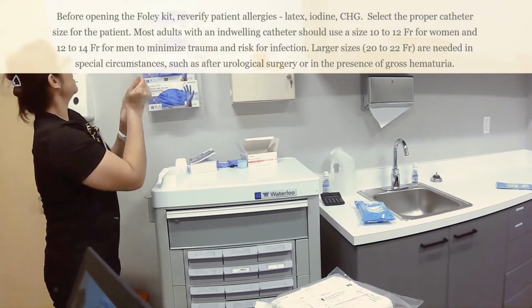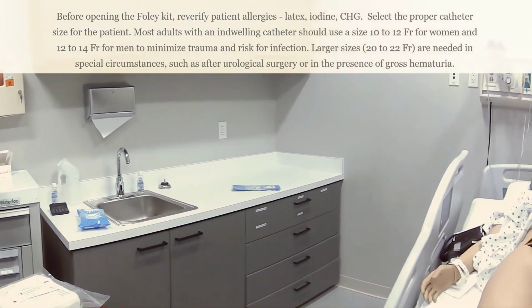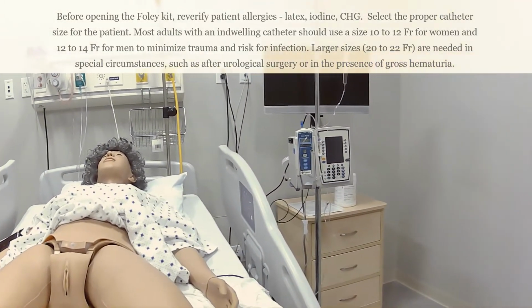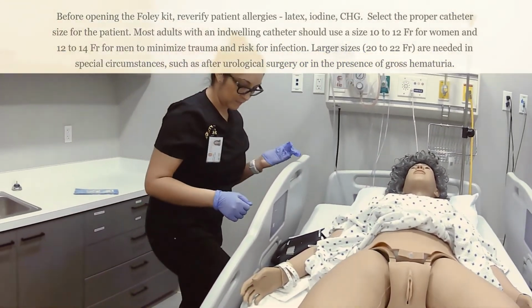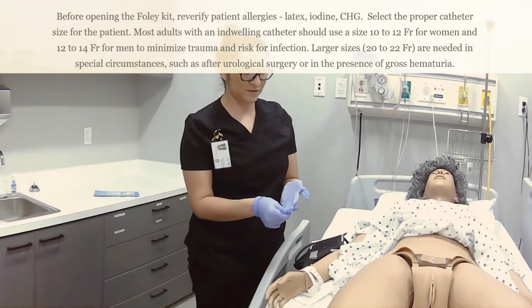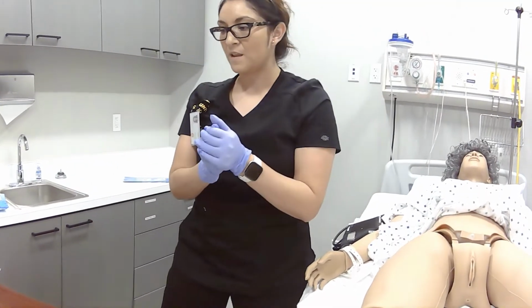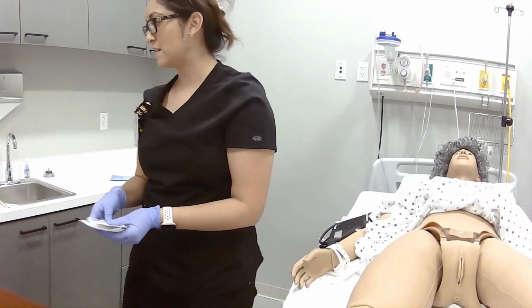Doing okay, Miss Adams? Yes. Just make sure you're keeping your patient safe, because that bed is really high. We don't want her to fall. And what you'll also want to do is put that side rail down, so that way you can get close to your patient for this next part. Okay? So I am putting on clean gloves to open my Foley kit.